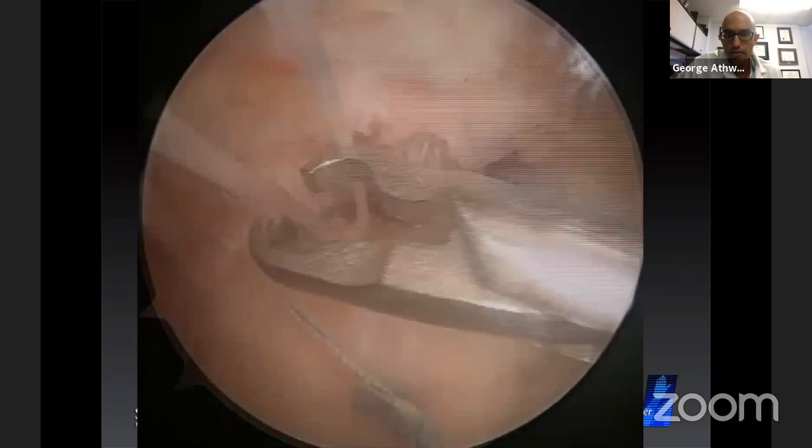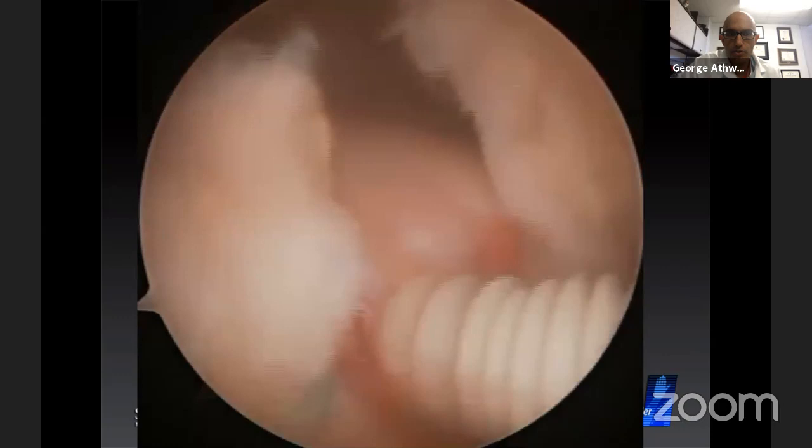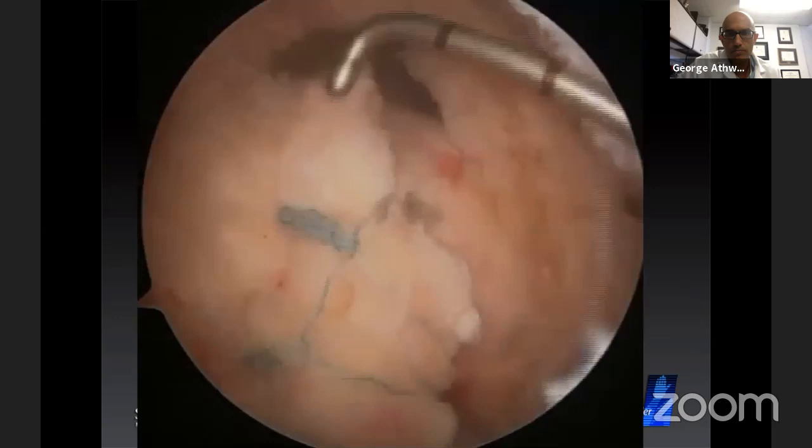And so now I'm gonna pick up one stitch from every anchor and I'll place a lateral row inferior anchor in the biceps groove. So we're gonna do some crisscross sutures. So this is inferiorly in the biceps groove, and this is superiorly in the biceps groove. And there's our conjoint tendon, and here's our double row repair of an isolated subscap tear.